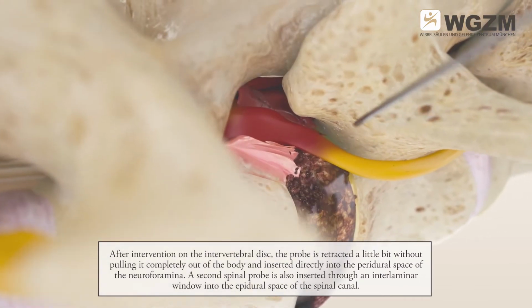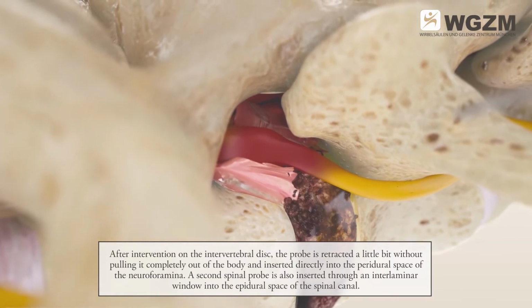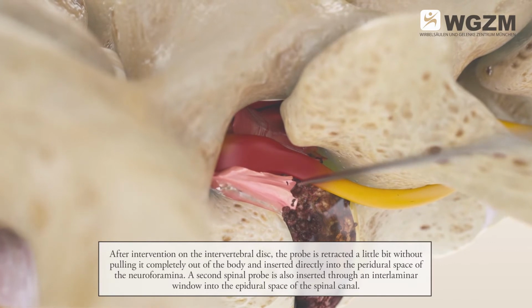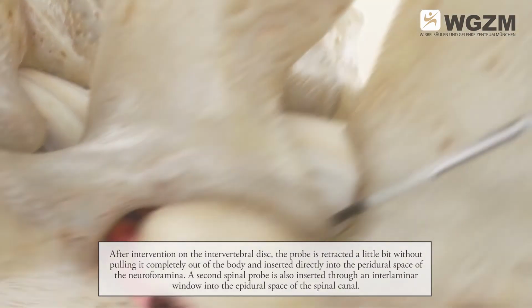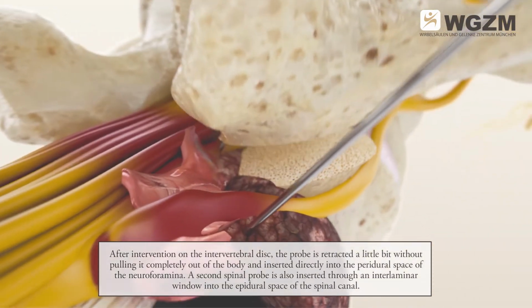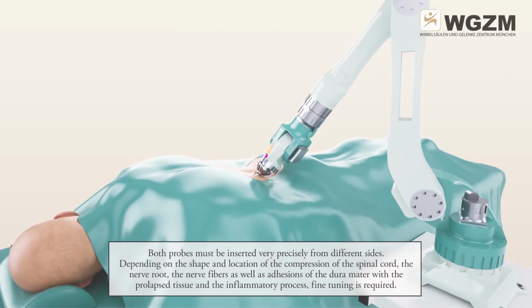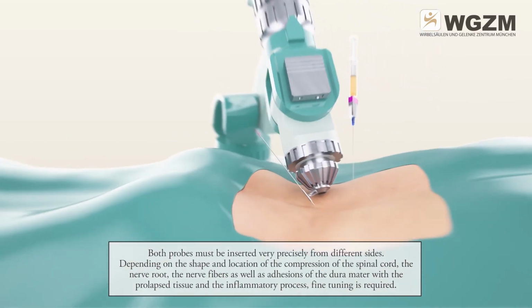After intervention on the intervertebral disc, the probe is retracted a little bit, without pulling it completely out of the body, and inserted directly into the peridural space of the neuroforamina. A second spinal probe is also inserted through an interlaminar window into the epidural space of the spinal canal. Both probes must be inserted very precisely from different sides.